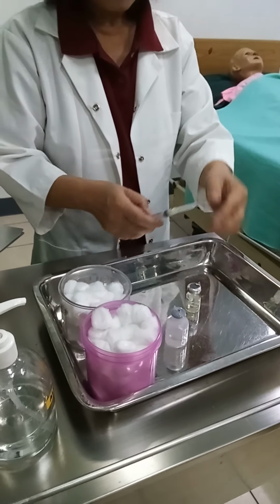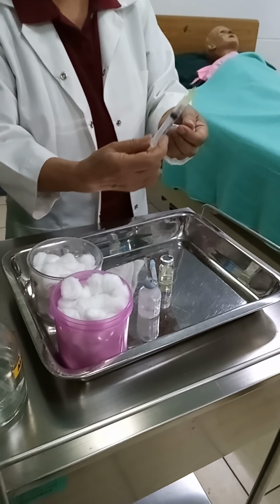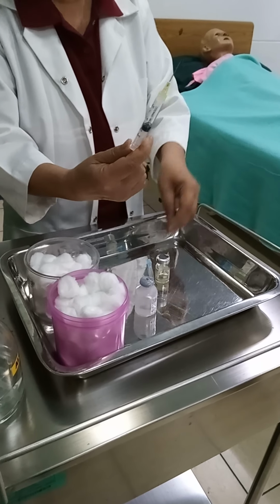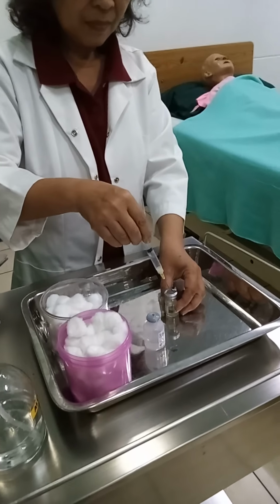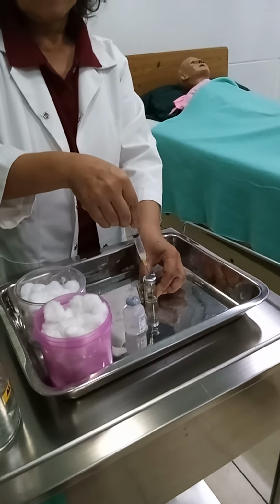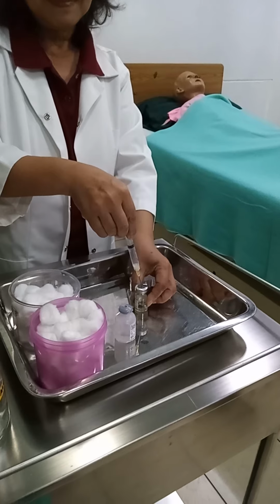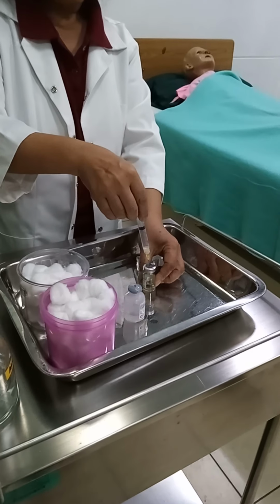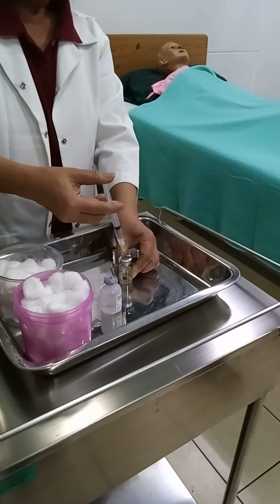When drawing up the medication into the syringe, remove the needle cap from the syringe and pull back the plunger to draw an amount of air into the syringe equivalent to the volume of medication to be aspirated from the vial. Set the vial on a flat surface and insert the needle tip through the center of the rubber seal.